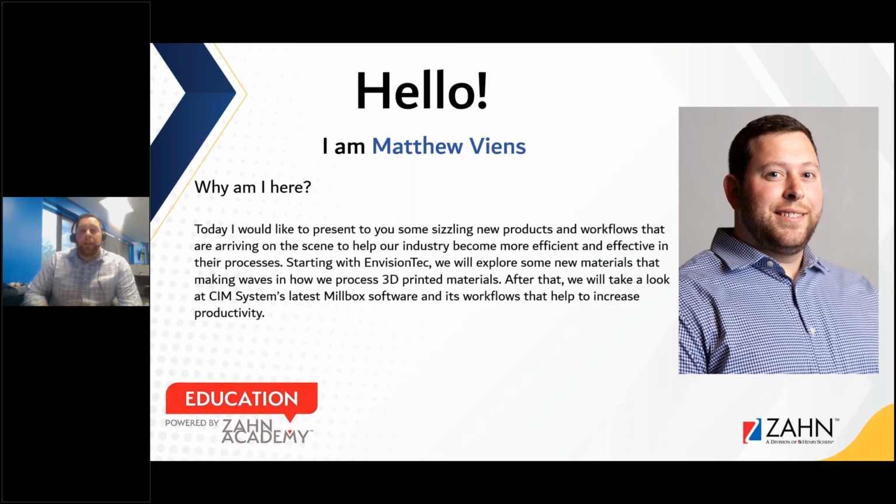So why am I here today? I just wanted to let you know what new products we have available and what different types of workflows we also have available for some software that we already currently see out there, but with new updates and features. I wanted to bring these to your attention so that you can see what is available to you, what's going to be new for the summer, and how we can utilize that to help our labs thrive throughout the whole process.